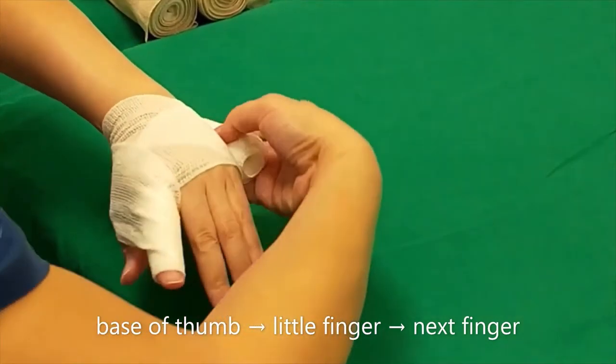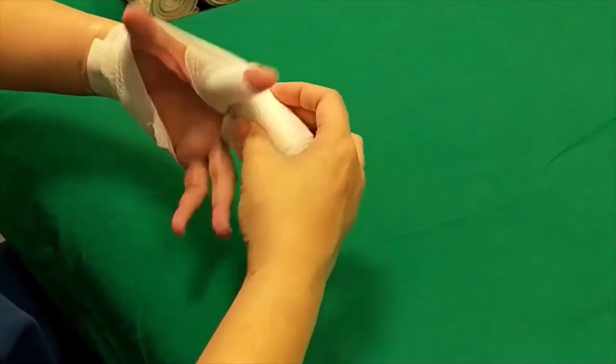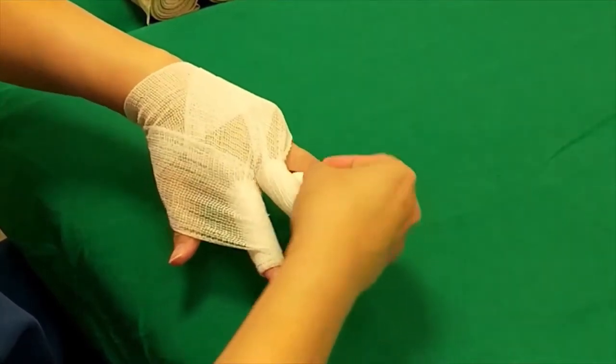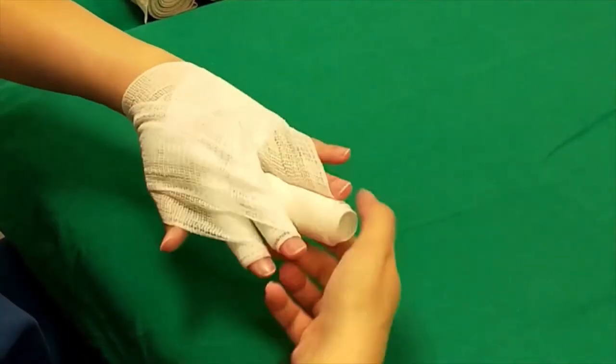Go down from the base of the thumb and come up from the little finger, then wrap the next finger.